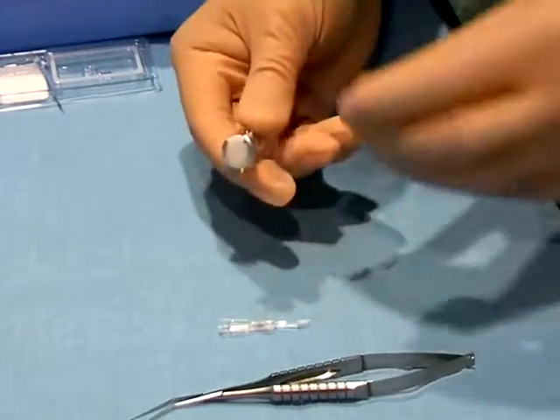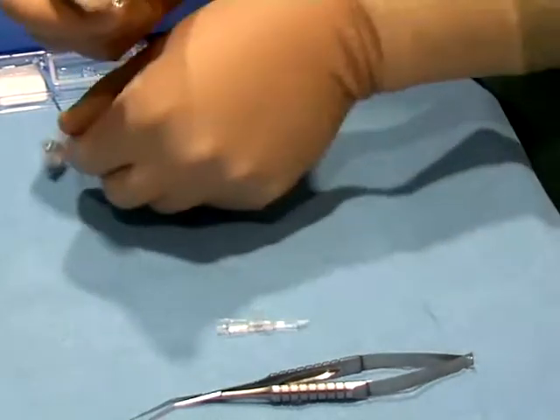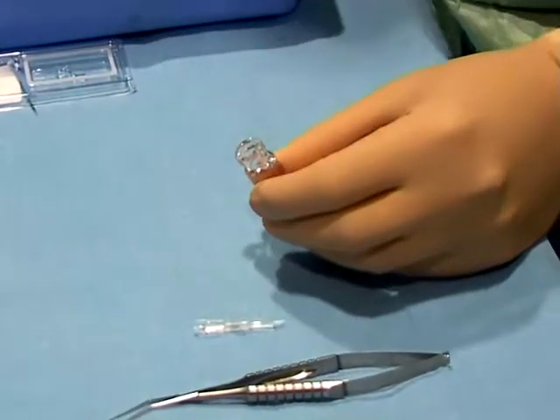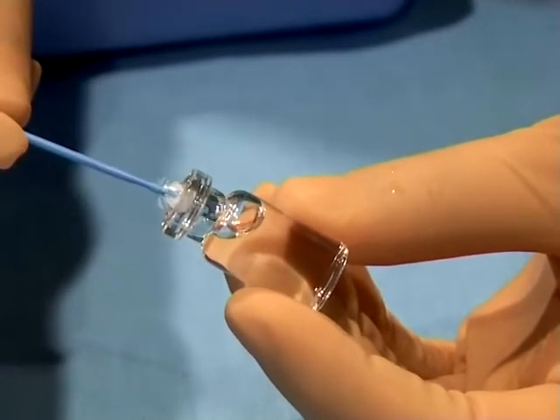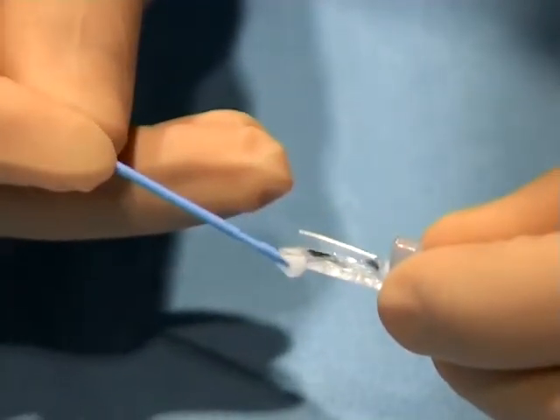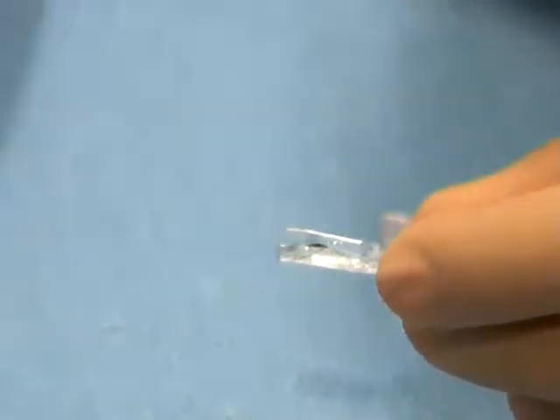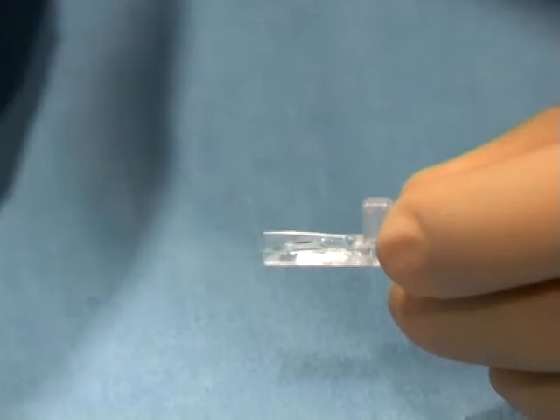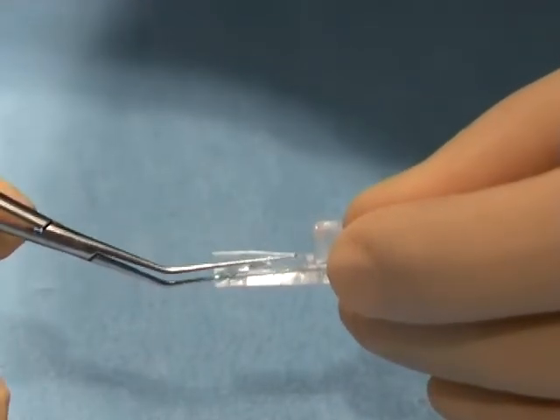The container is opened and with a soft plunger the ICL is removed from the bottle. The ICL is then positioned in the open end of the cartridge and with the Vukic forceps the lens is placed into the cartridge, pushed forward and tucked in.